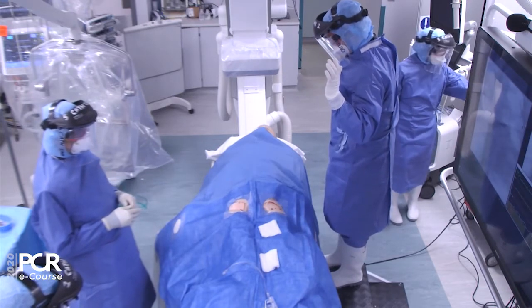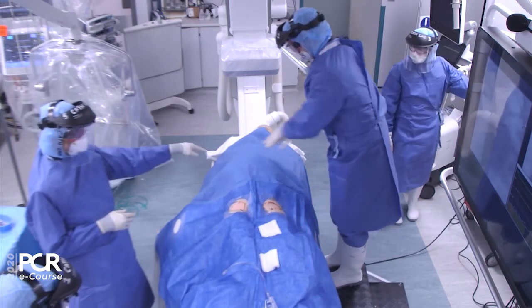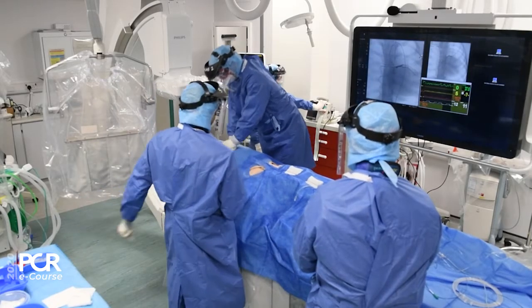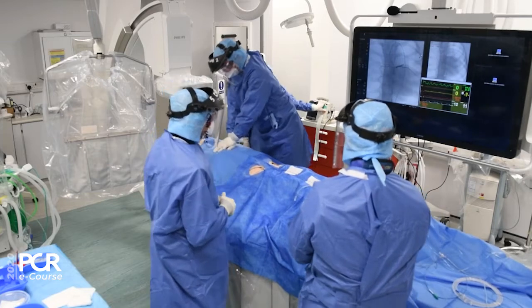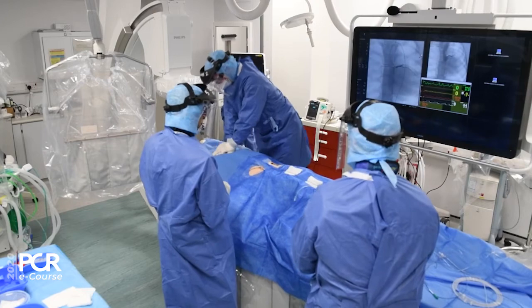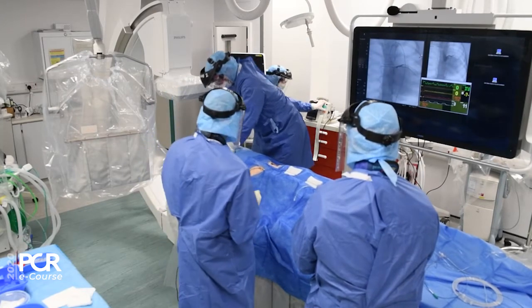Oxygen away, shock. Okay. Back on the chest. It's still VF. Okay, CPR. Another 2 minutes, please. Make sure adrenaline's ready. Where's the anaesthetic team? Yeah, we already called. Okay. Fantastic. Keep on with the CPR. Tell me if you're getting tired.